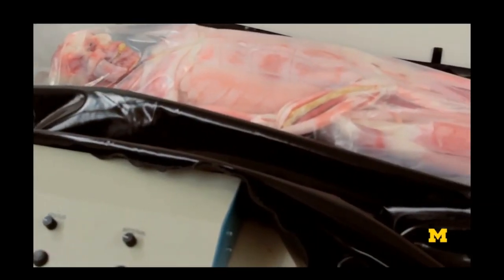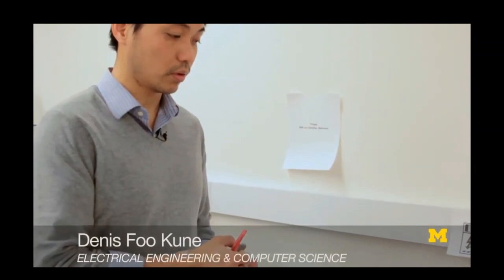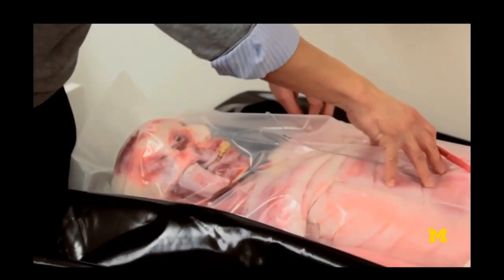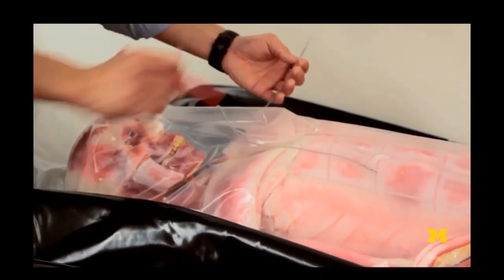Tomorrow's medical devices are going to be much more interoperable, different devices talking to each other, and it'll be so much more important to secure that wireless communication between all those devices. This is an experiment setup for the security of medical devices. We're using a synthetic human. Particularly, we're looking at interference.